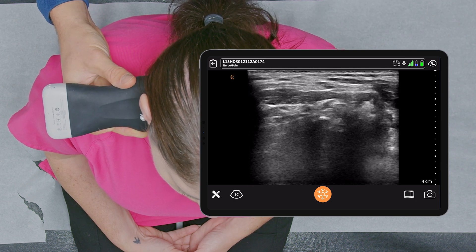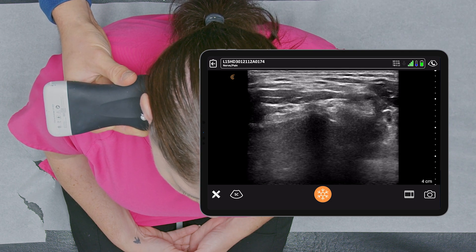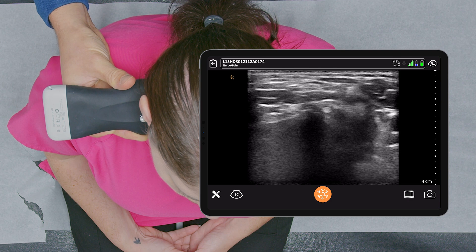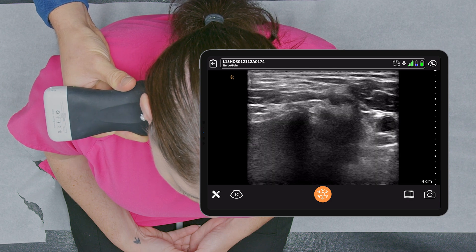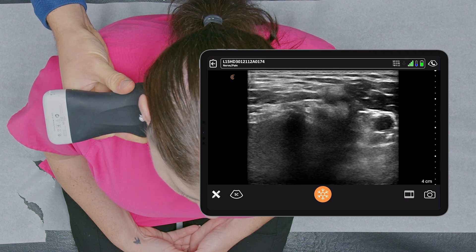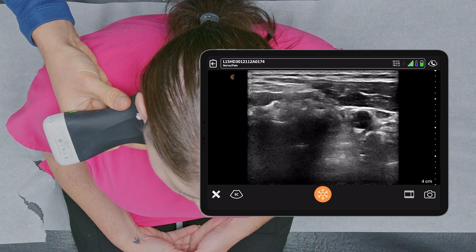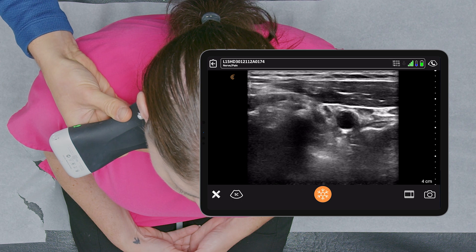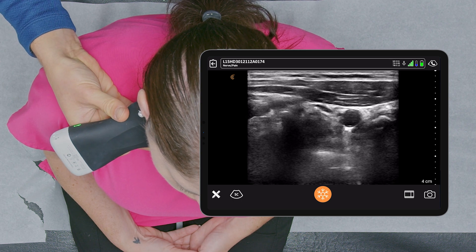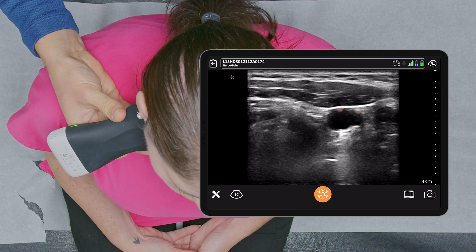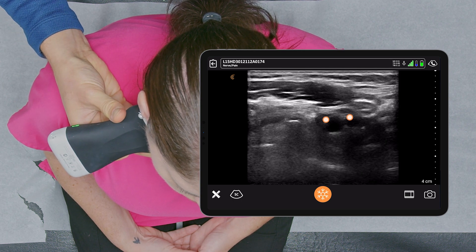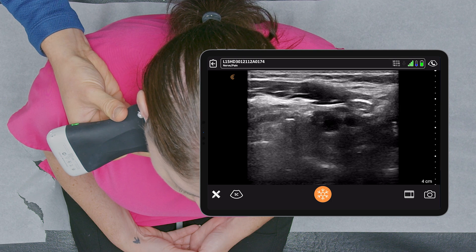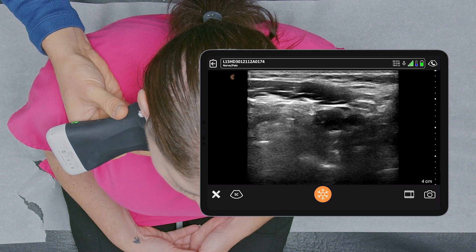So once again, the posterior tubercle is larger above C5, and that's more or less how we know we're around the level of C4. Also, the carotid artery will bifurcate, as you see here, at the level of C4 or C3 in most patients.